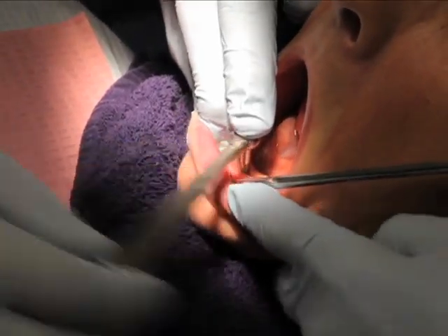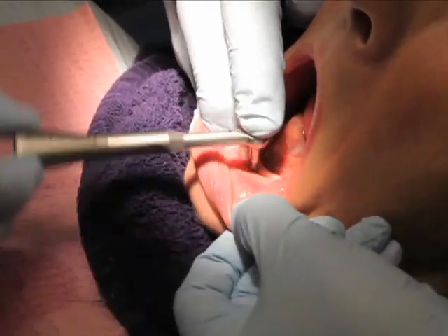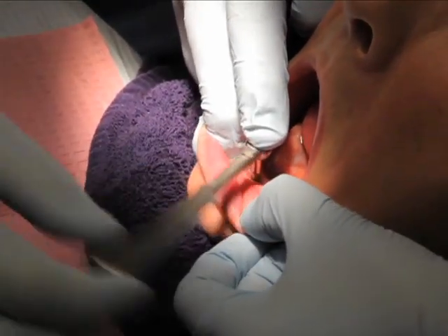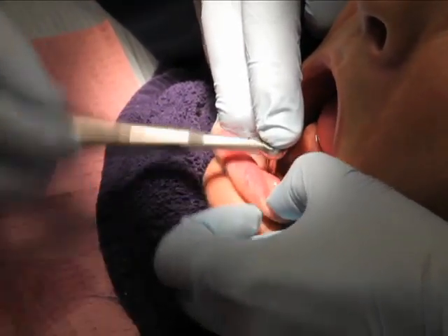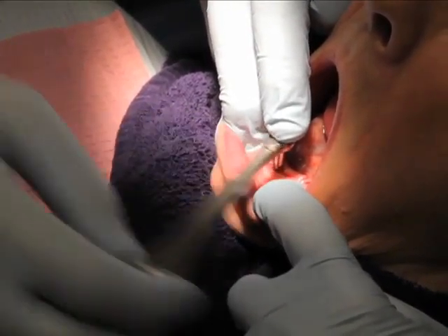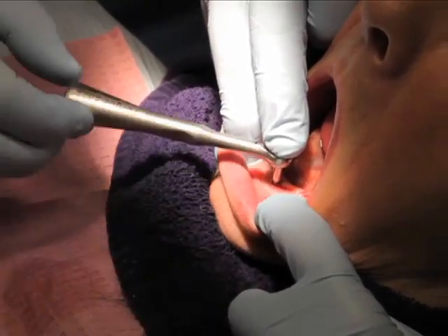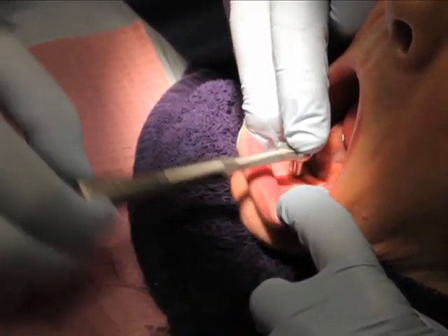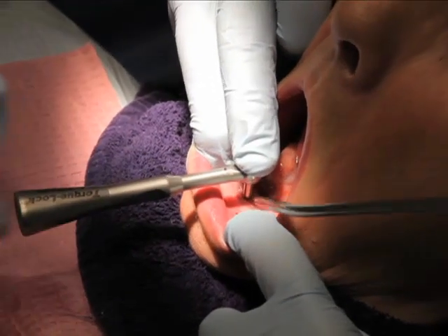As the implant bottoms out, the bone is condensed at the apex by the threads and at the crest by the mini threads at the bottom of the tapered collar. Once the implant was placed, an additional few turns were given to condense the bone at the tip and wedge the cortical threads into the cortical bone, creating this mechanical lock at the top and bottom of the implants.